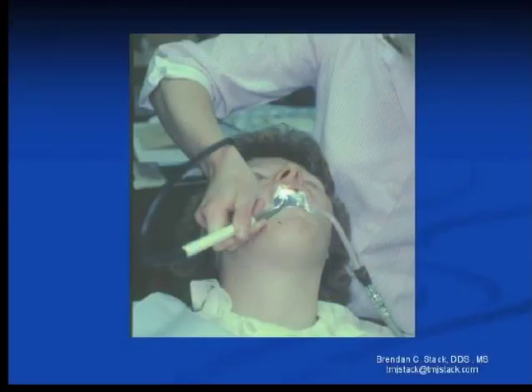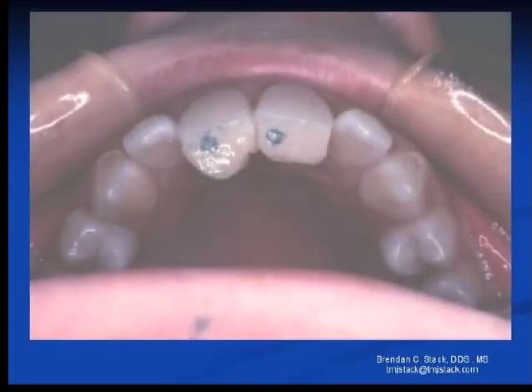This is the incisor buildups being applied to the maxillary central incisors. Bonding material is used here to make lingual shelves. This is what it looks like when the bonding material is applied, and you can make these either flat or hollow ground them so the lower teeth fit into them like a keyway, or you can make them slanting upwards and forwards, so that when the lower teeth hit them, you have built in an anteriorizing interference.